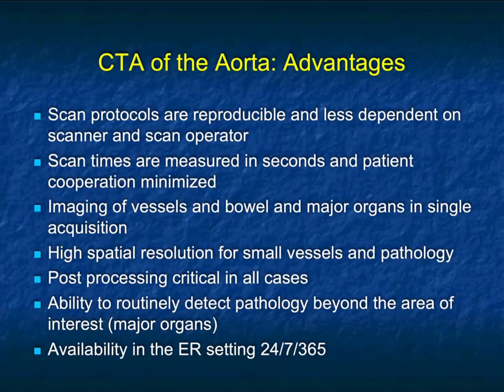So I think about CTA of the aorta. I was putting together some talks, and it made me think about advantages. Nothing really brilliant, but scan protocols are reproducible and less dependent on scanner and scan operator. So we can do this in small and large hospitals, in the hospital, in outpatient centers, as well as the ER.